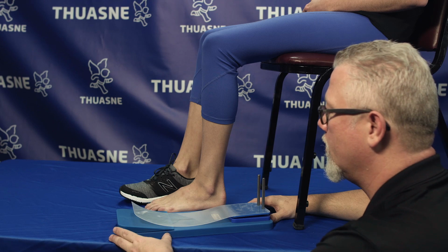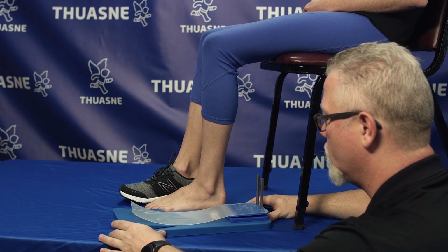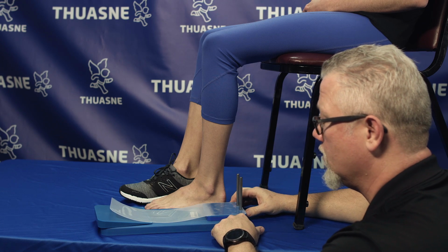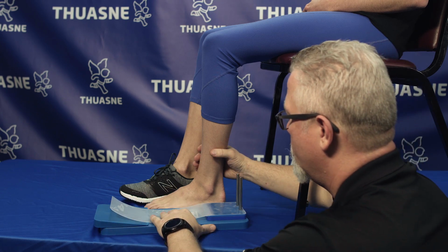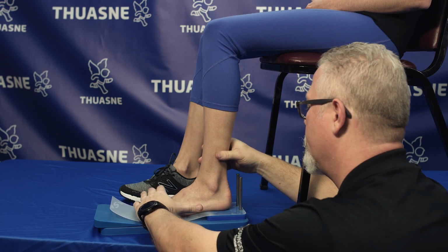Once we've completed our clinical evaluation and we've measured the shoe, now we're prepared to go ahead and cast the patient. It's essential to use the exact number for the heel height to place on your casting block. You also need to ensure that we have added the toe extension board as well. We're going to place the patient on the casting block, ensuring that we don't get too close to the metal pegs.